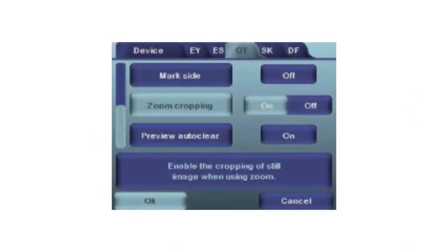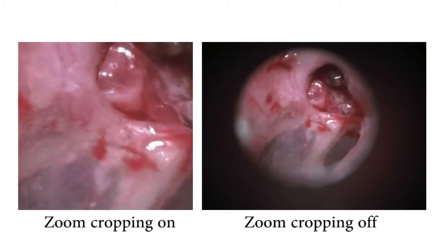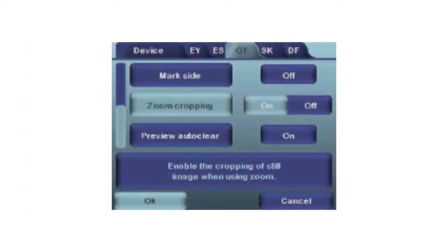Zoom cropping. When zoom cropping is enabled, the camera will save the zoomed area instead of the entire image area. By default, zoom cropping is turned off. When activated, the camera will save only the area that is visible on the camera screen when the user has zoomed in, rather than the whole image.